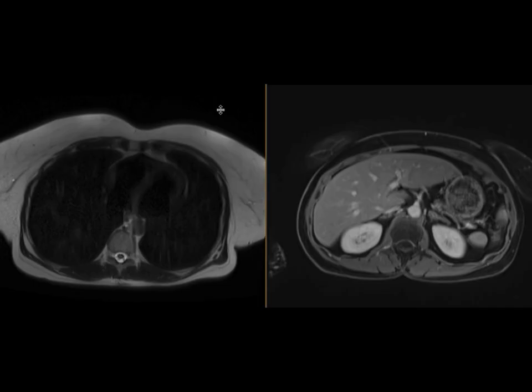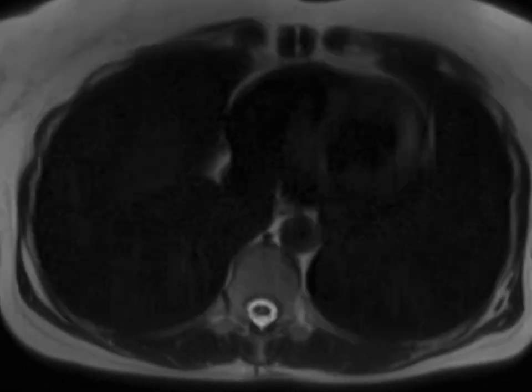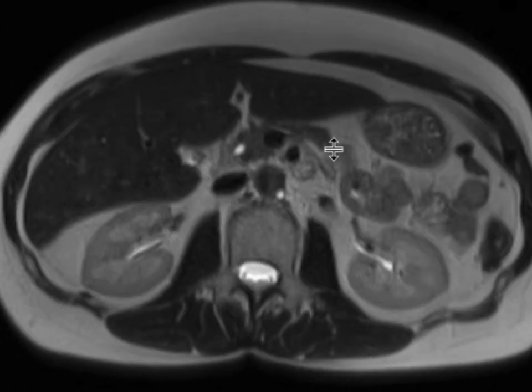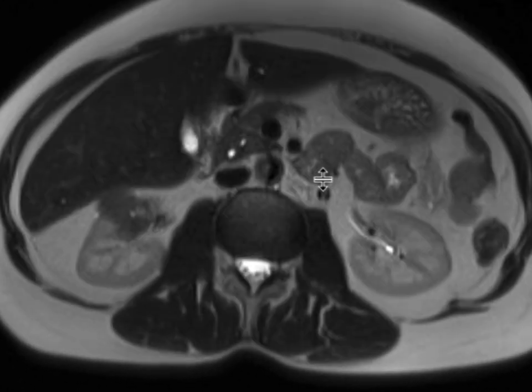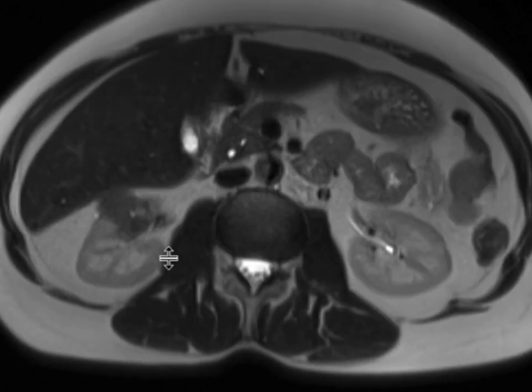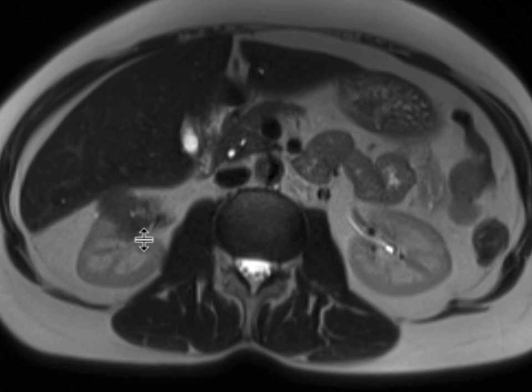This is a patient who has a renal mass that we were asked to characterize, so an MRI was obtained. We have our T2-weighted images without fat sat, and you can see the mass in the right kidney — this sort of almost bilobed lesion extending a little bit into the renal sinus over here.